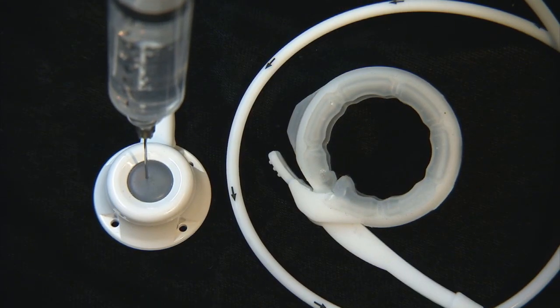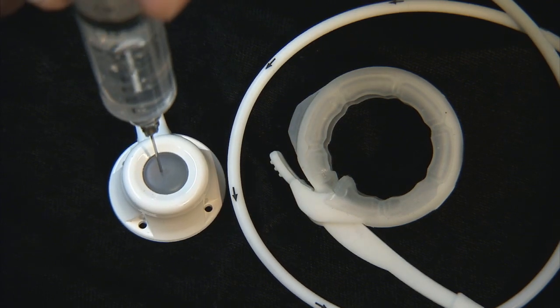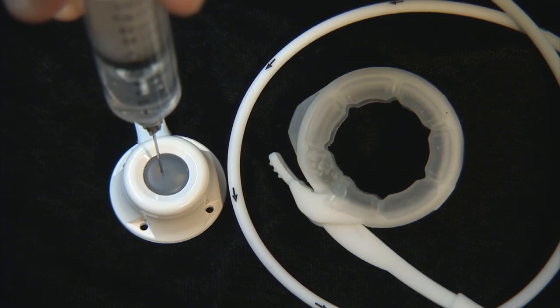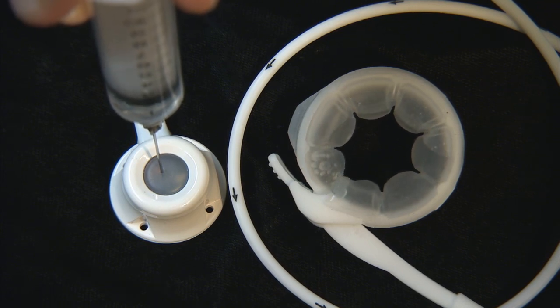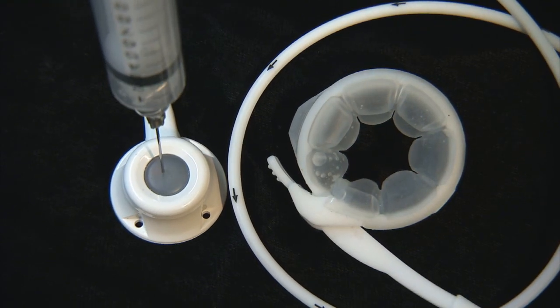Seen here is the laparoscopic adjustable band. This is the AP band and you'll see the volume going in now: here's one cc, two cc's, three, four, five, six, seven. This balloon will hold up to 12 cc's. And now it's being deflated.